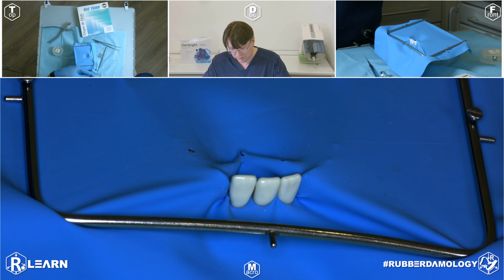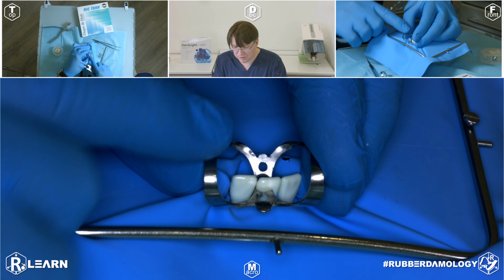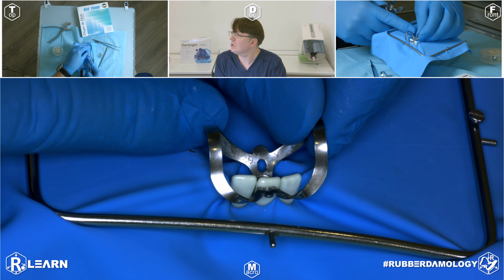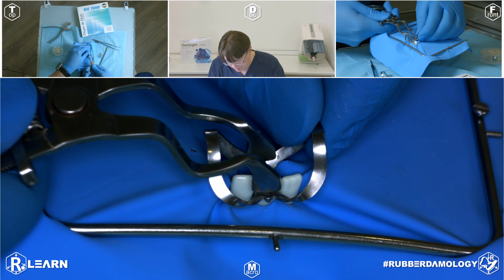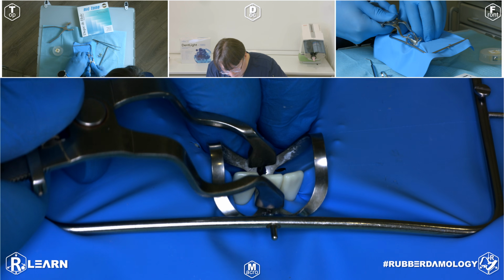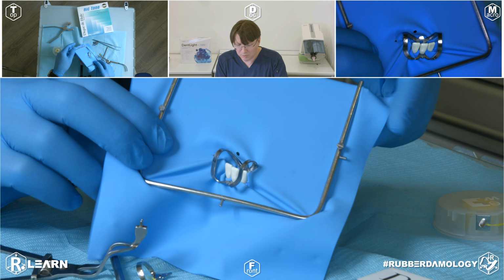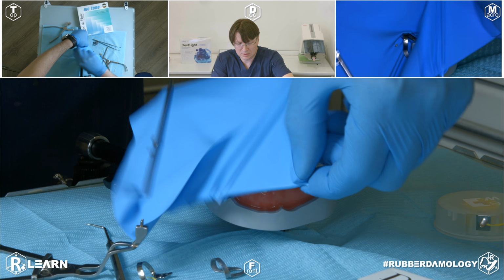This is the wrong one, because you have a bigger radius vestibularly, but you need it directed to the lingual side. And then fix your rubber dam with clamp number 9 on tooth number 41. Very fast. Make an envelope to finish your exercises.